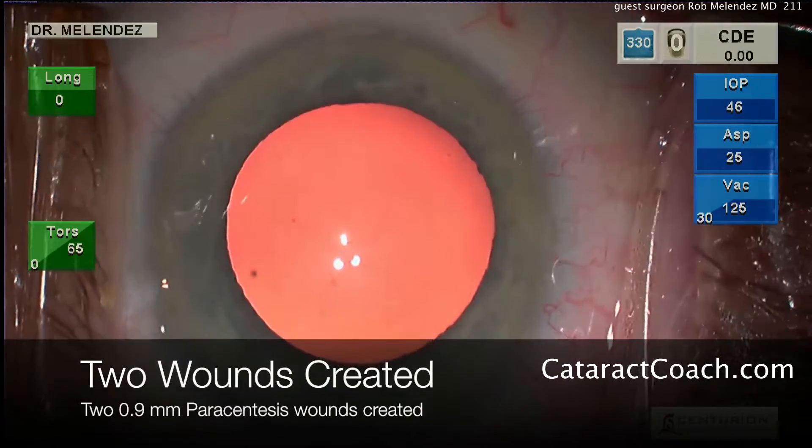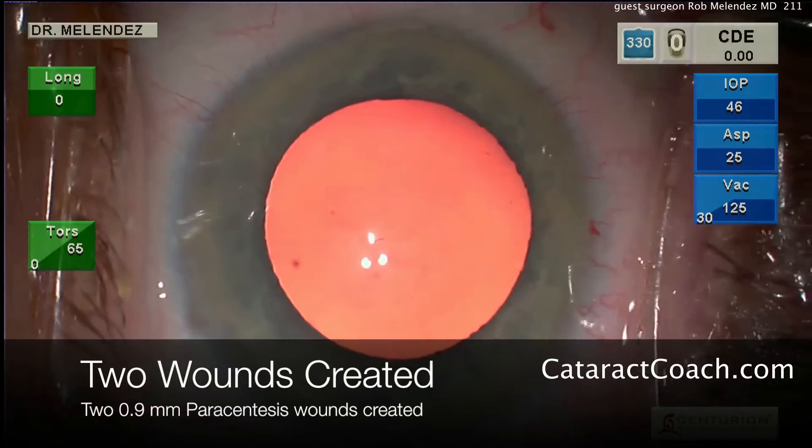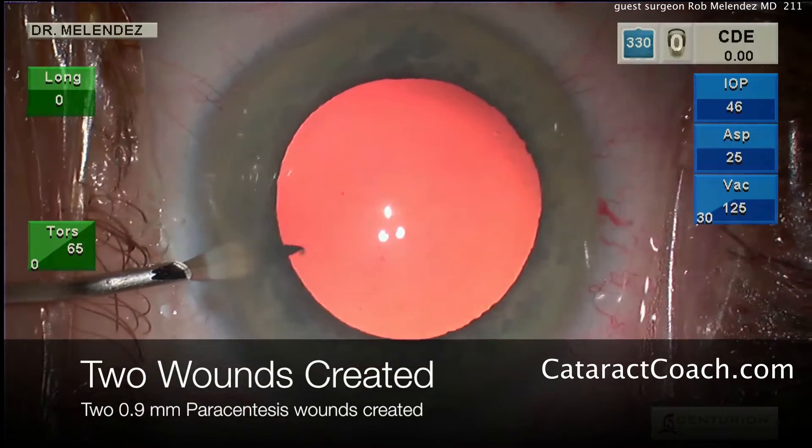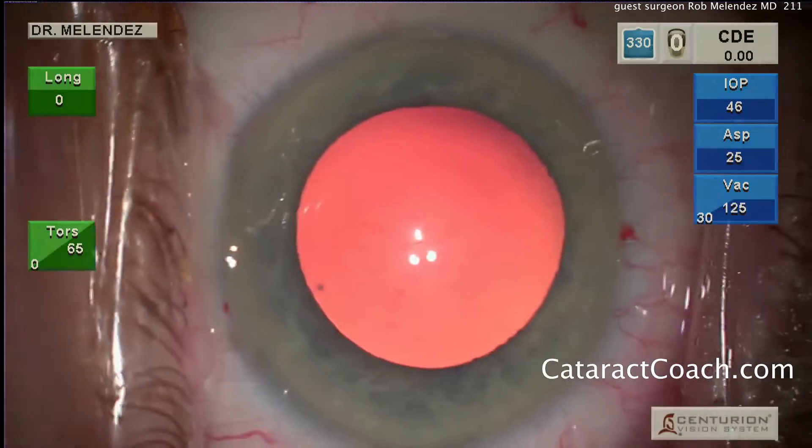He starts off by making two paracentesis incisions, about 180 degrees apart from each other. He's using a 0.9 millimeter blade to achieve this.